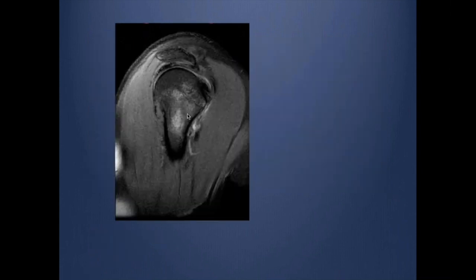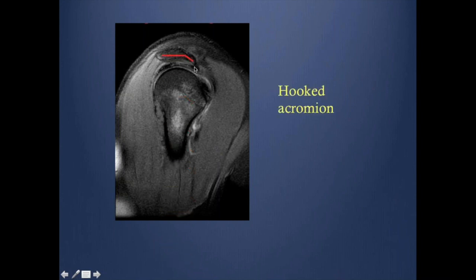Abnormal shape of the acromion — if you see this configuration, which we call the hook morphology, this is at risk of causing impingement. This is what we call a hook acromion.